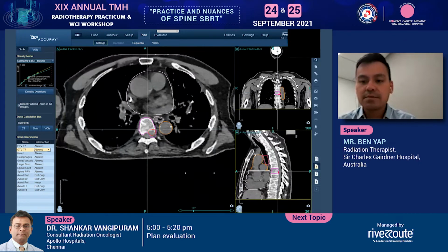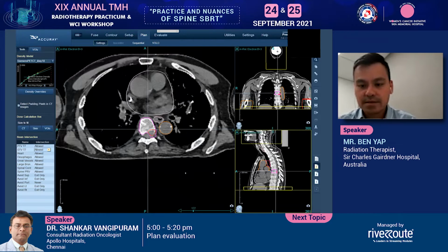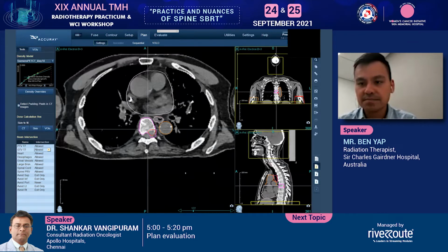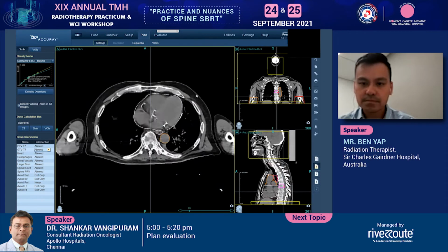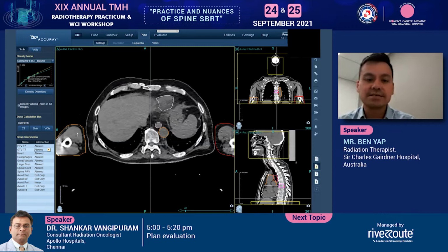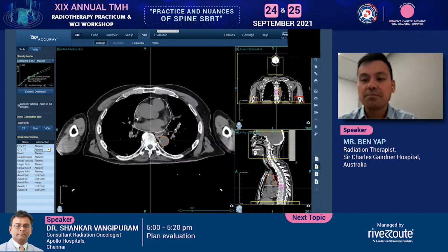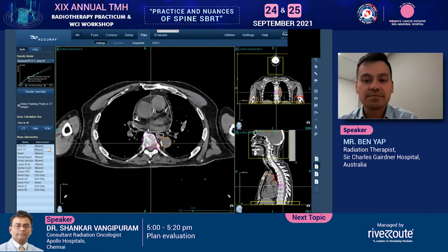Now, as I already said to you, this patient has his arms down. So just to demonstrate, I'll put on these contours. What I've drawn are contours like the head inferiorly, and if you can see here, the arms. Because I don't want to treat through arms, because of the uncertainty. So this is inconsistent as you put the patient on the bed every day, and because of that, if we can avoid it, and because there's an air gap as well, we don't want to treat through arms. But we'll allow for up to the armpit and above. And it's entirely up to you, but we find that that is pretty stable in a patient.